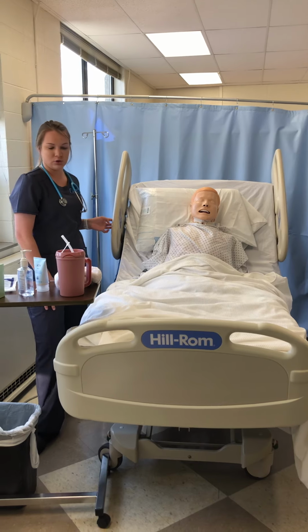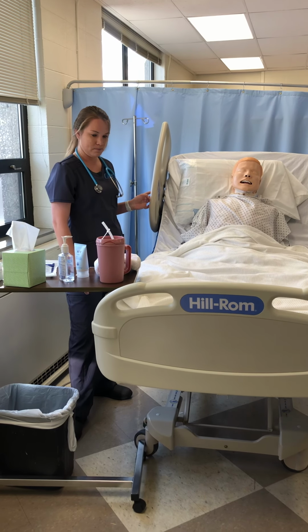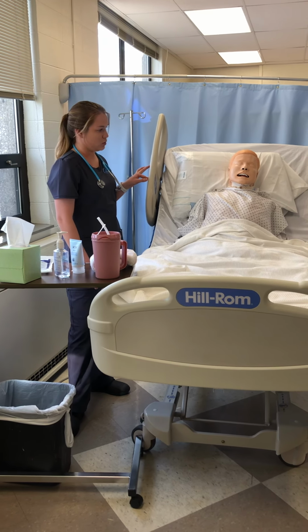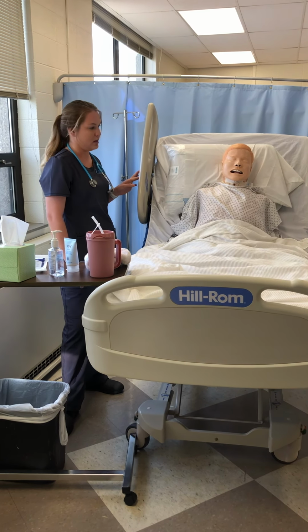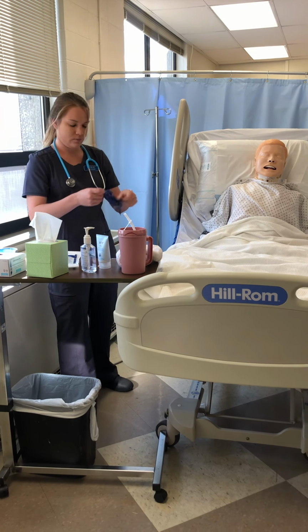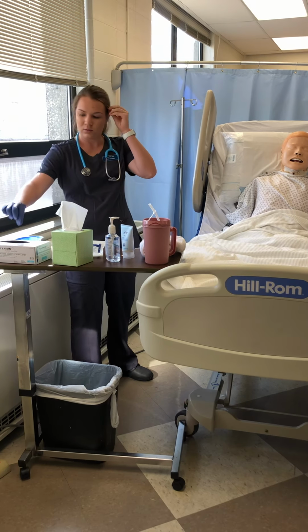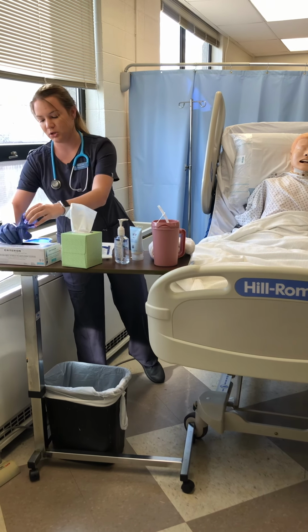I would close the curtain to provide for privacy on my way in. I'm going to put my bed to a good working height and assist my patient into the high Fowler's position. And I'm going to assess my patient.